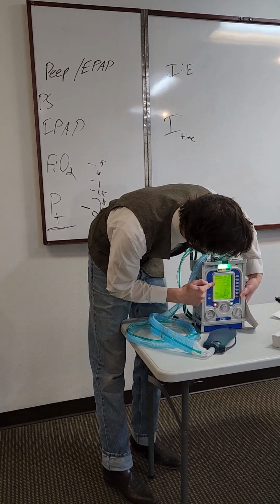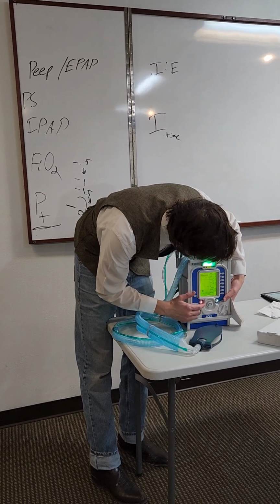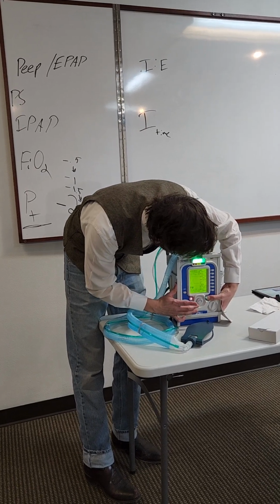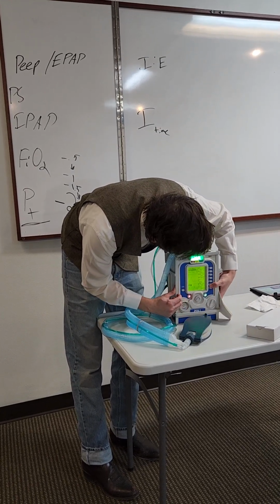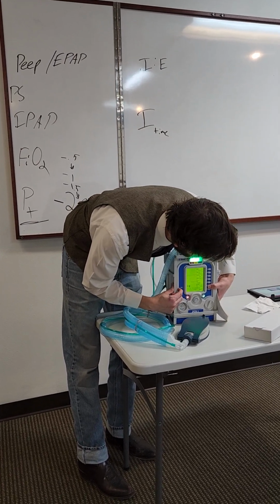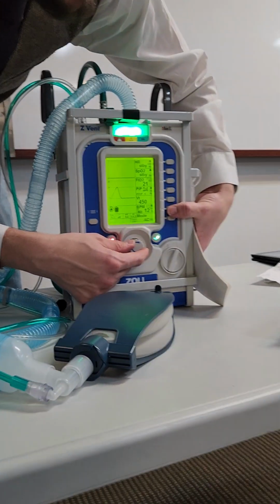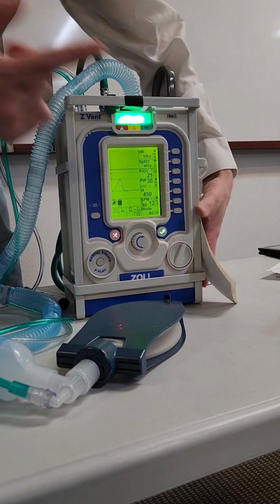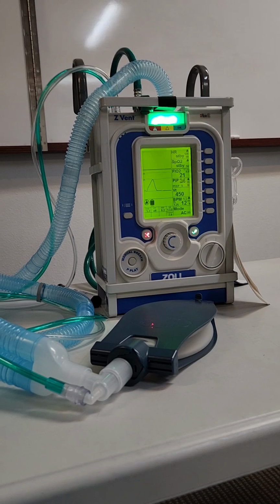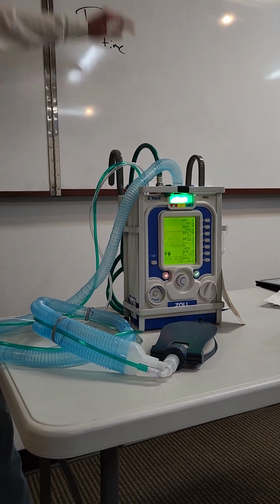And here we're going to have 3 additional parameters. So control parameter IE, if I select that, I can change it to TI, which is I time. Now, if I circulate around this box, I go breaths per minute to the alarms of breaths per minute to the I time. And I can change the I time down to something that we would normally see, like 0.9. You see that all the time. 0.9, 1.